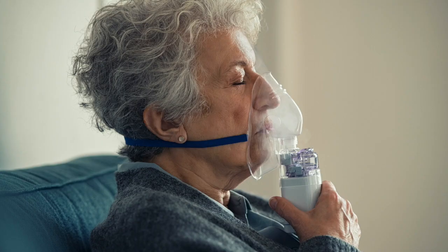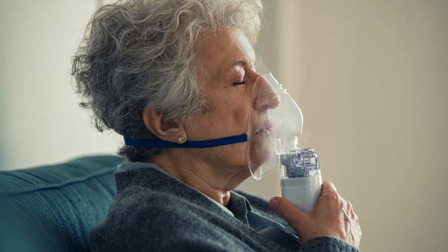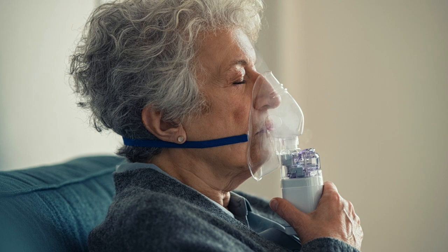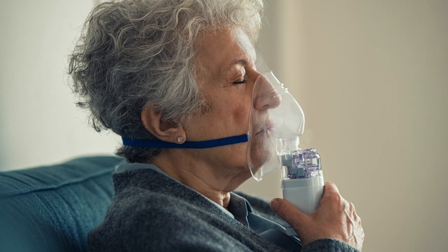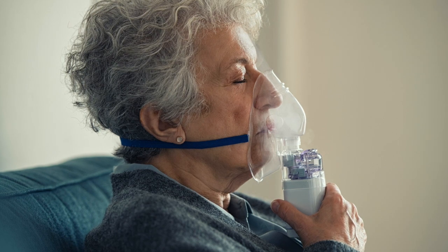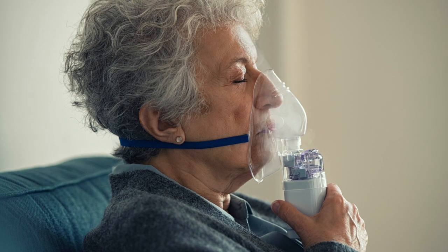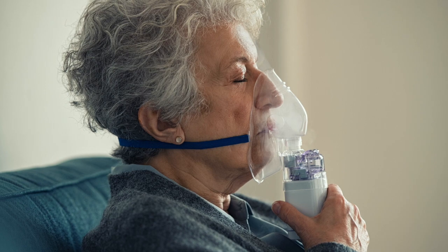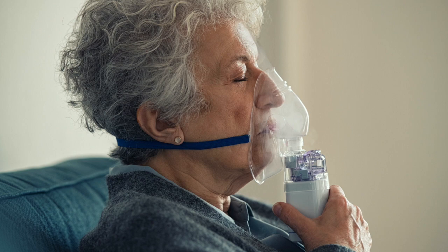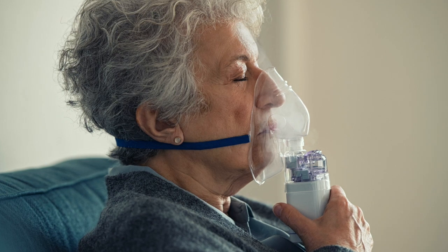When mechanically ventilating the COPD patient, we must increase expiratory time to prevent air trapping. By increasing expiratory time, we will prevent many complications, increase compliance, and improve patient comfort. Often, this simple adjustment from the baseline 1:2 ratio on the ventilator to a 1:3 ratio will prevent any issues from arising in this population.